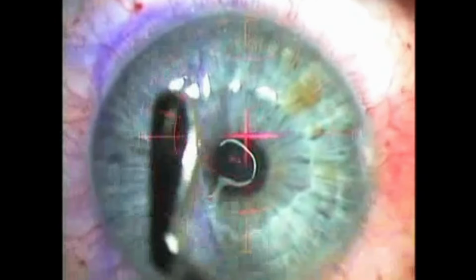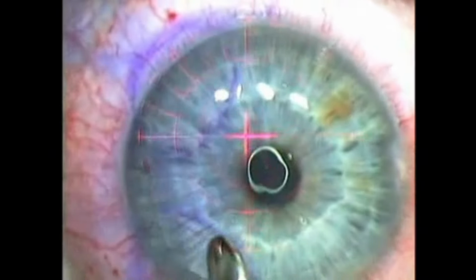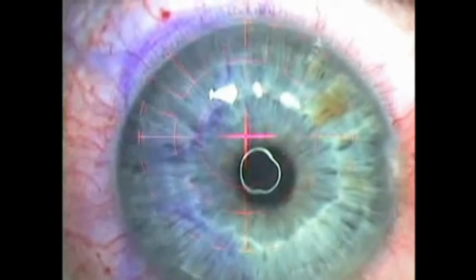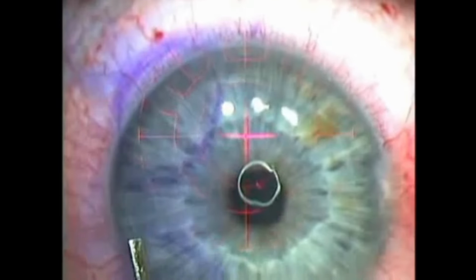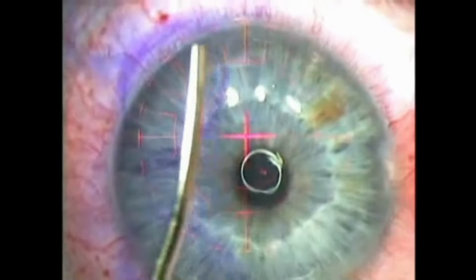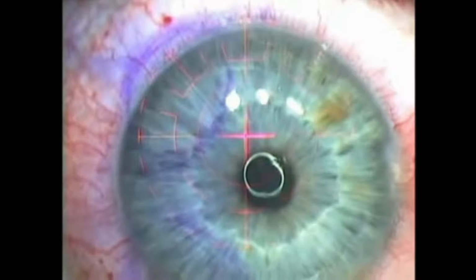The central cornea is untouched during this part of the procedure. The other end of the spatula can then be used to bring forth any epithelium that might be underneath the flap on the edges. As you can see, there's only approximately a 1 mm overhang. In this case, and in many cases, the epithelium fits back in position with no overhang whatsoever.